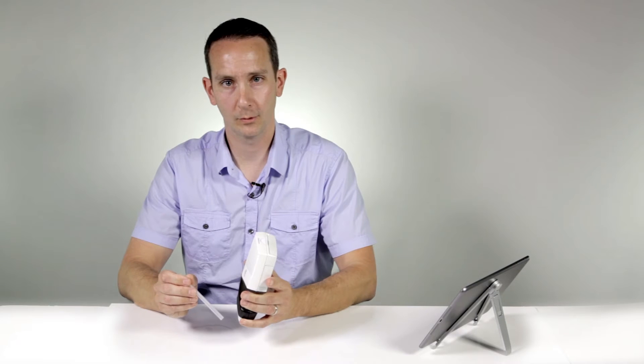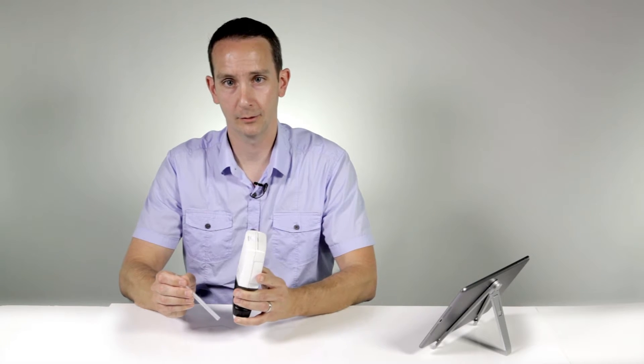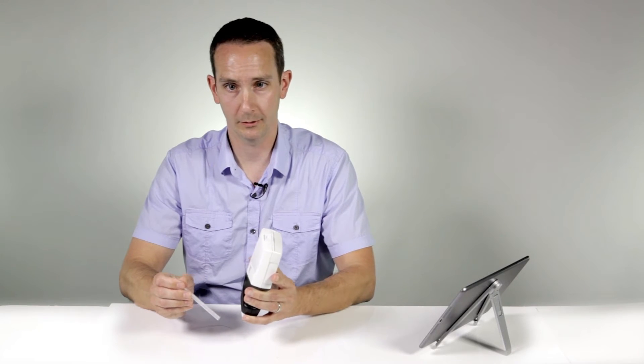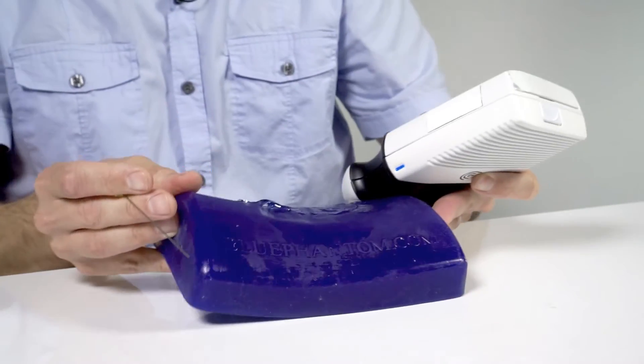The trick with the short axis is that you never want the needle tip to get in front of the ultrasound beam. At this point you've lost the needle tip and you may as well be doing this blindly.